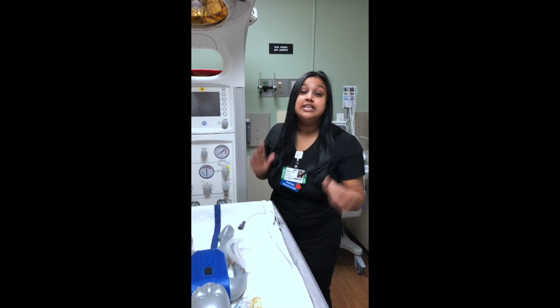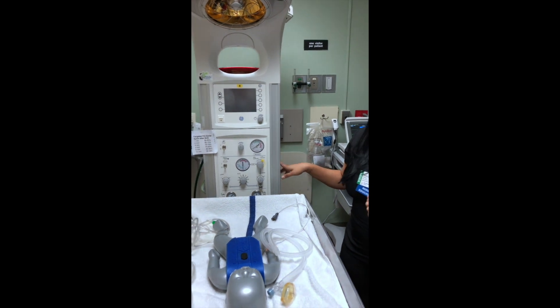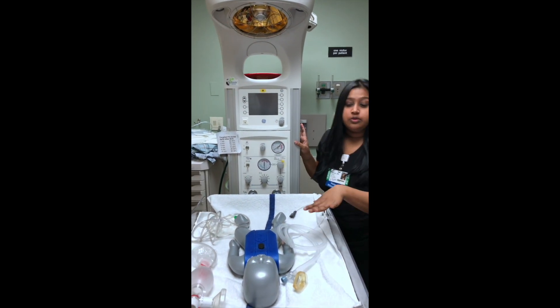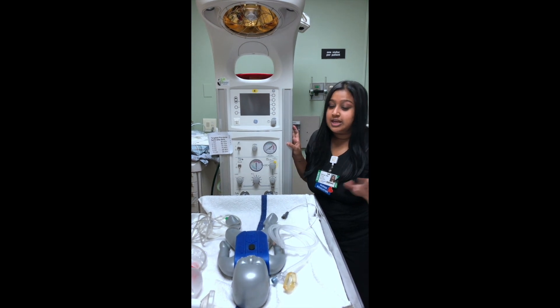Hi, my name is Felicia from LAJ Valley Stream. Today we're going to be using the Panda Warmer. First, you're going to bring the Panda Warmer out and you're going to hook it up. You should get it prepared when you realize there's a baby coming, or if you get a phone call from EMS that a baby's coming in.